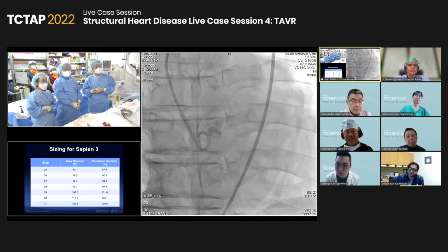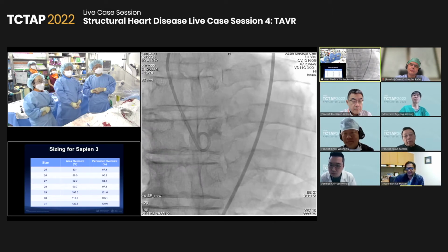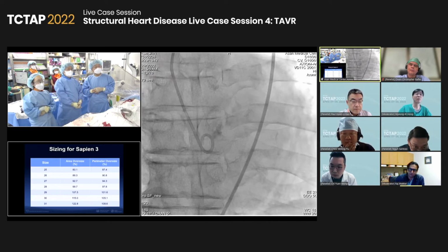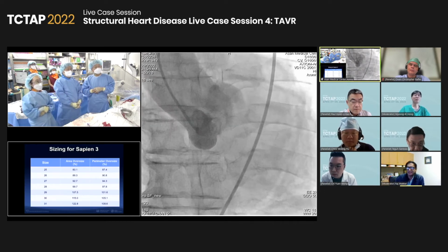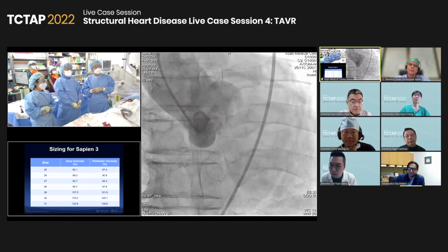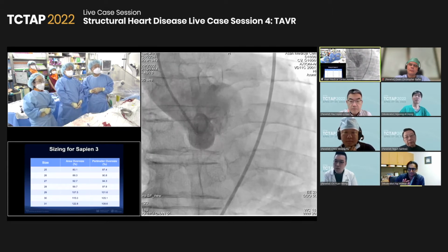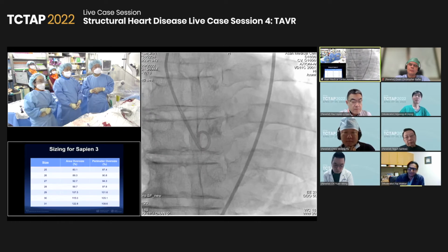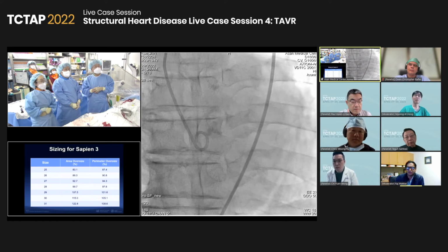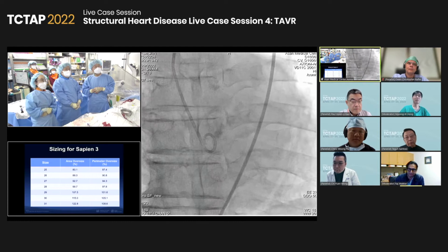29 with a couple of extra cc's available, and I think some operators will connect with a stopcock to the pressure gauge. We don't do that, because with the 29 inflation device there's no pressure gauge, and I think it's reasonable. People who use that will normally not exceed 6 atmospheres the first time they inflate it, but I think two extra cc's available, and then you see how you feel it. If you need to leave a cc behind, that's okay, and that's the way we do it.